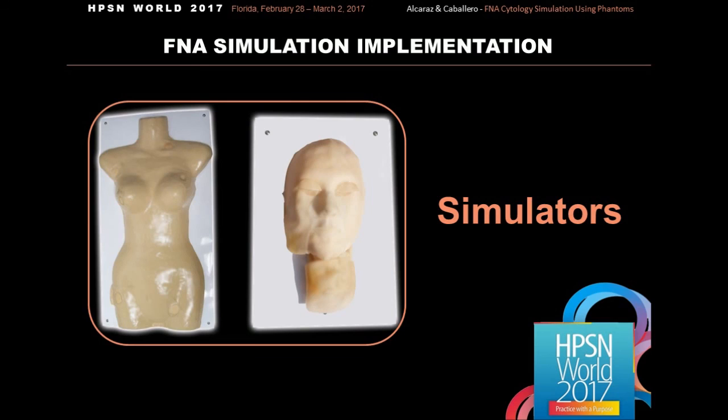So what do you need if you want to implement this type of simulation in your hospital or university? Fundamentally, you would need simulators. And then, for further correlation and understanding of the diseases, you will need slides in a conventional way with microscopes or digitized.